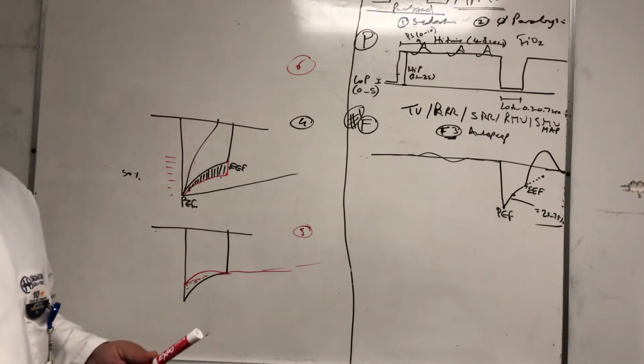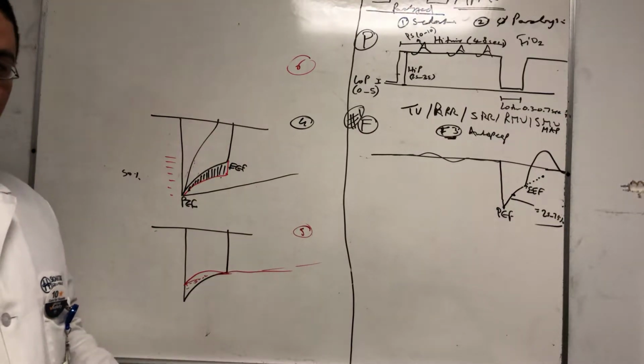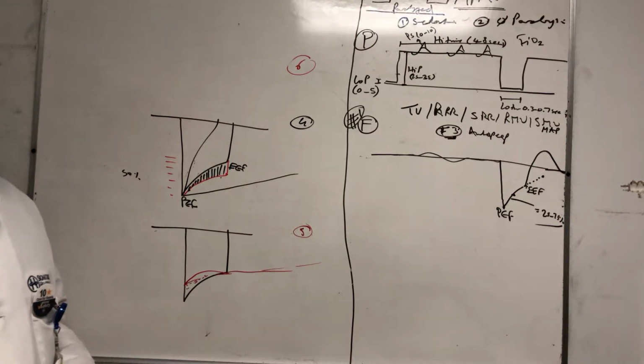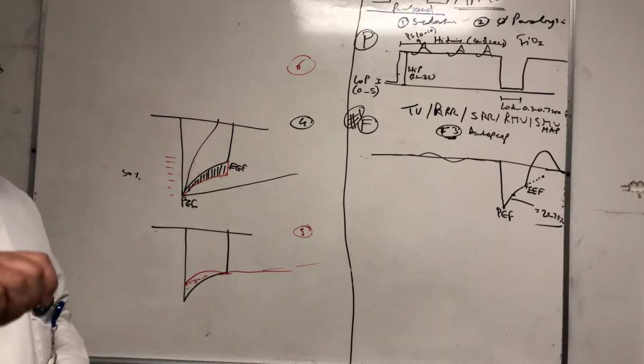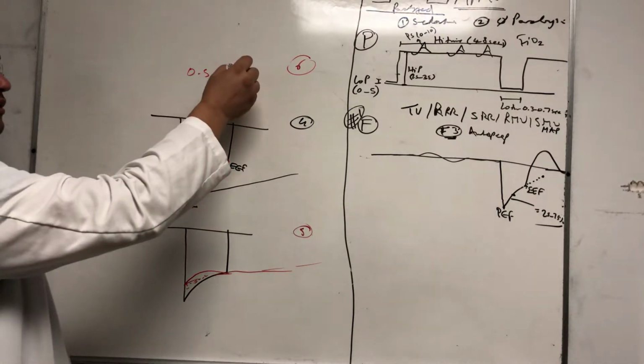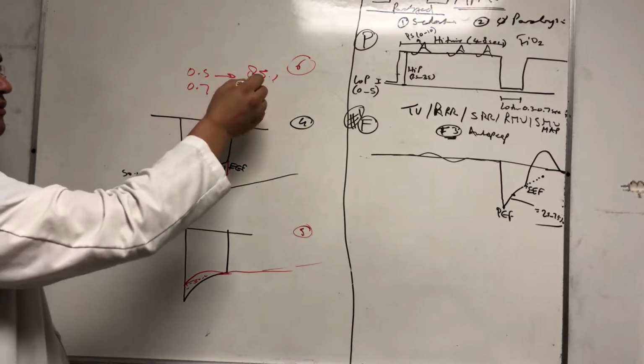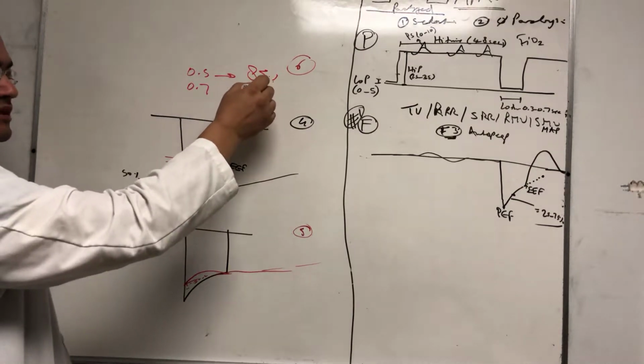So if you order the normal settings and you find the ratio is 50%, then this patient is probably ARDS more than COPD. If you find that the ratio at, let's say, 0.5 second is like 85%, then we prolong it to 0.7, and that's still 80%.